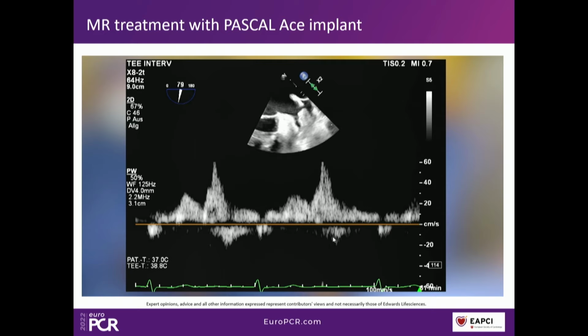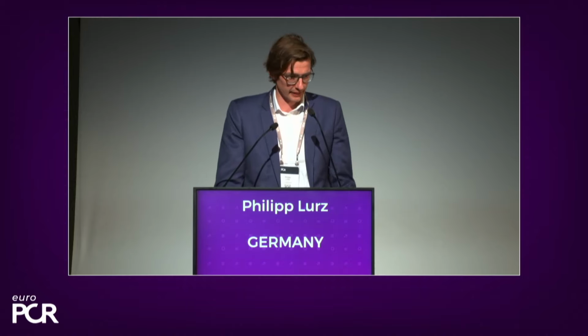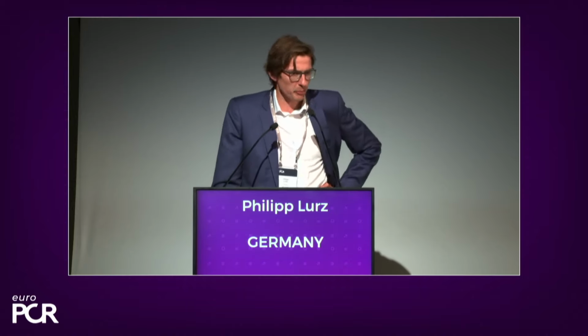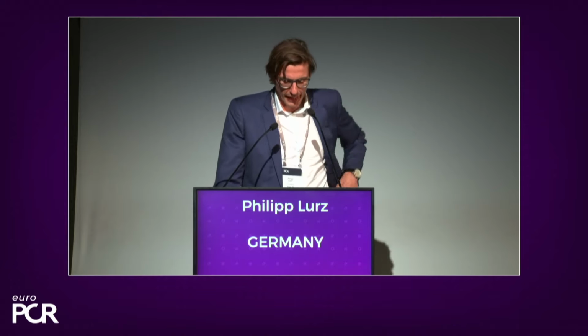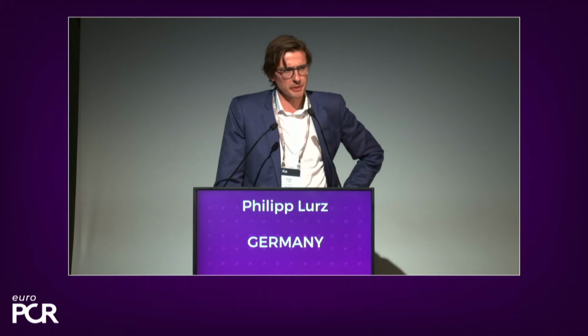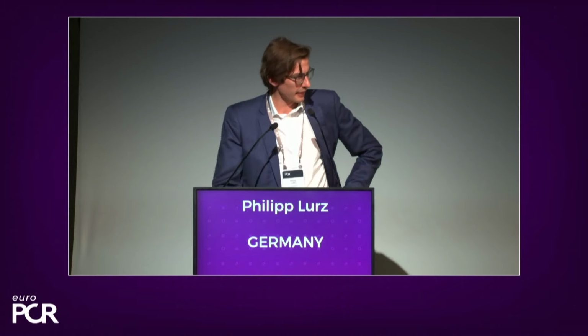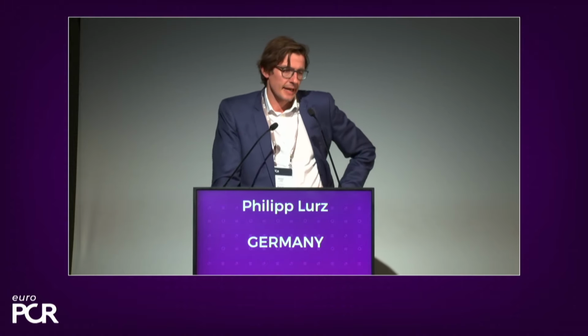Okay, you can hear that our echocardiographer is quite strict, but that's good, because that gives us better results. He was also not very encouraging to start with, and said that it's not a very good idea to select such a case for live in the box. But we tried anyway. As you could see, we crossed the valve with the device being closed. We normally would not do that for mitral procedures, but because we had to go very commissural, in that case we actually did it.